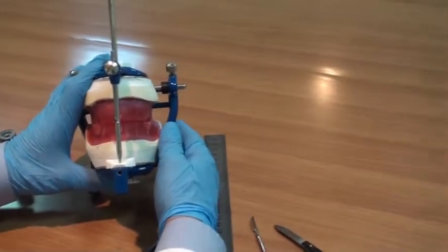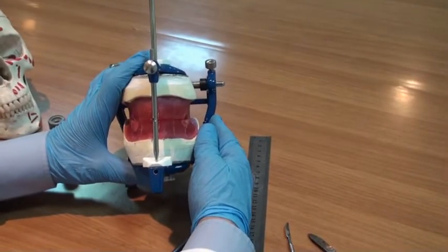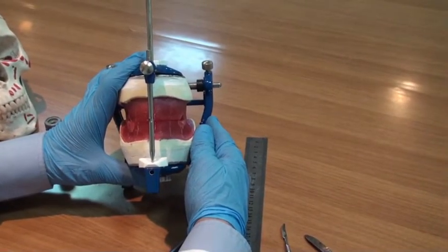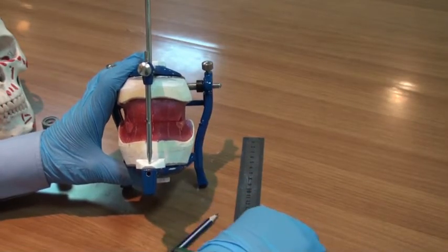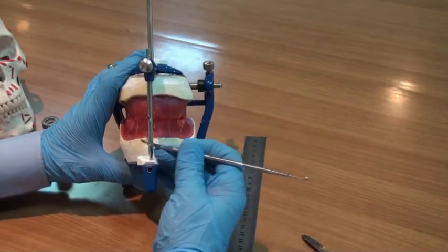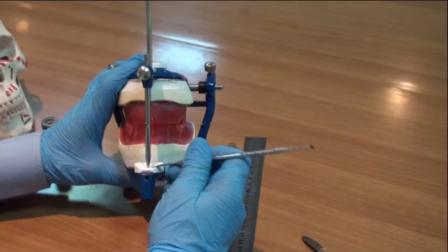Now, teeth must not alter these movement paths of the articulator, and this can be assured and observed by following the movement of the tip of the incisal pin against the incisal guidance table during setting of the teeth one by one.